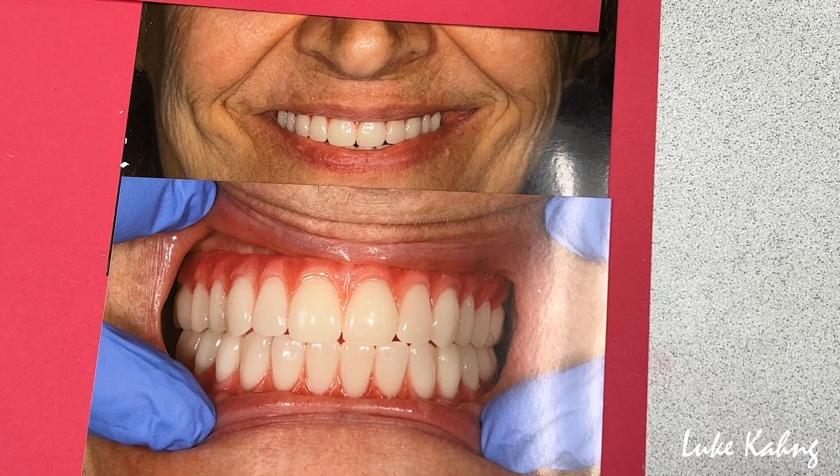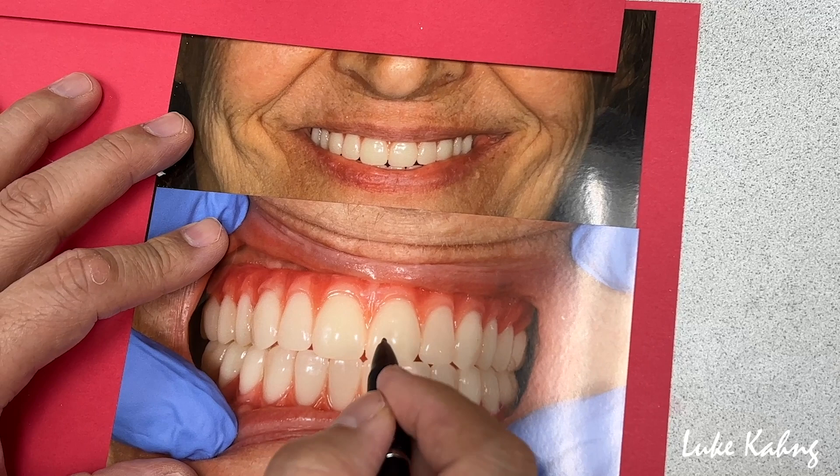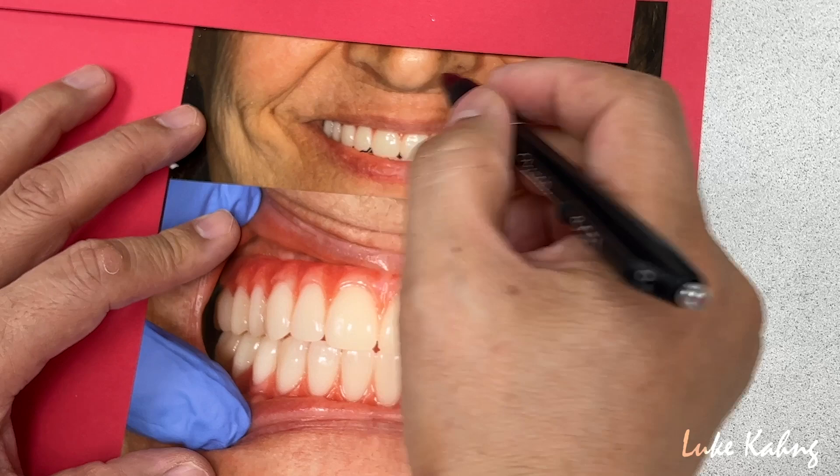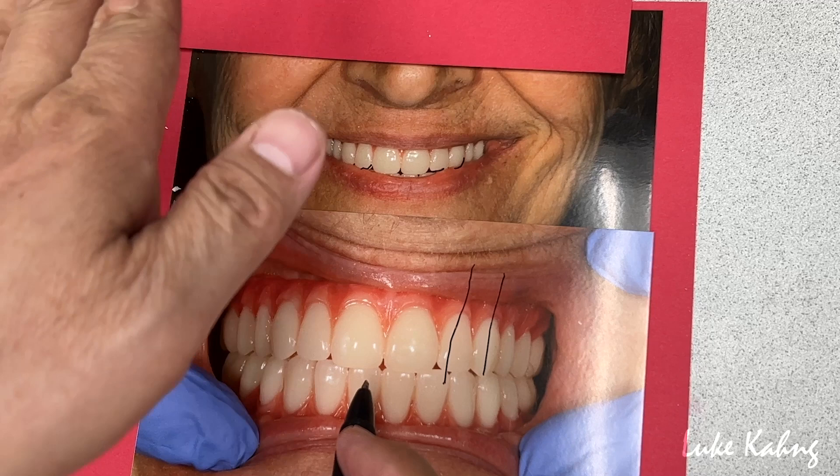I want to arrange the teeth from my experience. First I bring in the centrals, then I like the lateral and canine shape — the midline should be okay. The only thing you can change is on one long axis; I like to bring it in on the long axis, and then it will be okay.